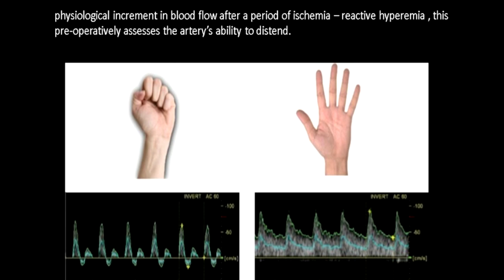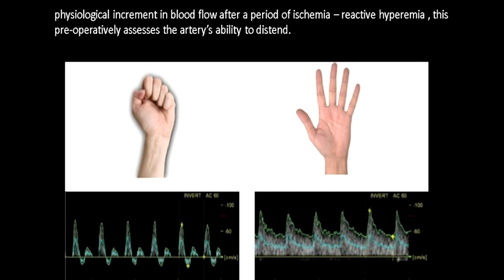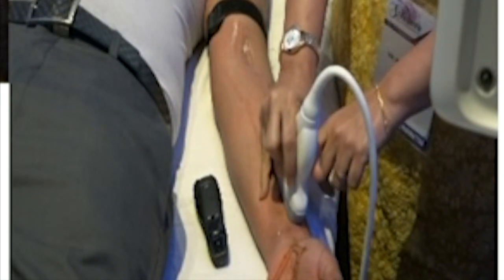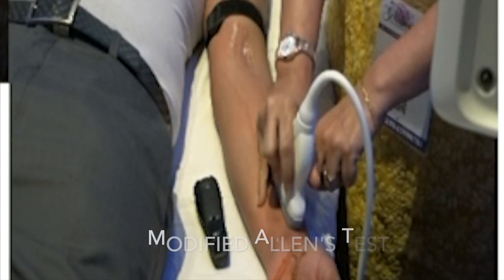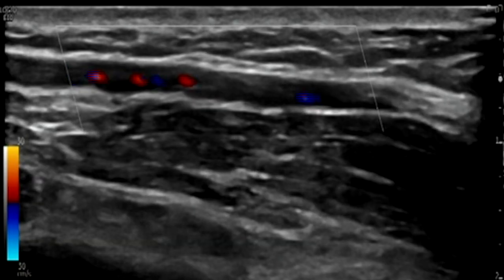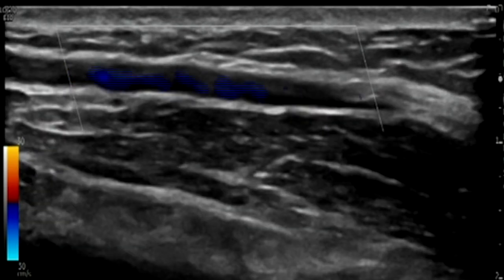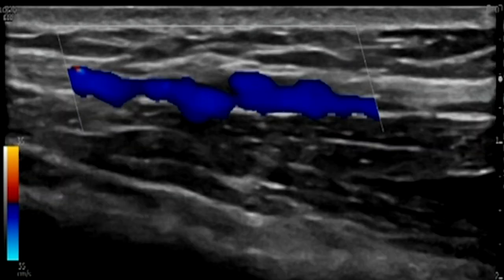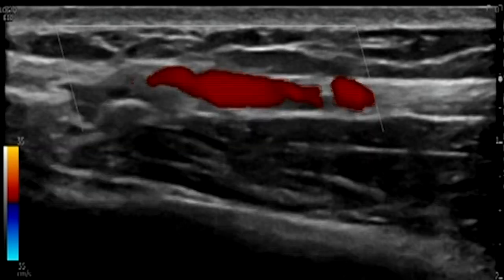Reactive hyperemia pre-operatively assesses the artery's ability to distend — its elasticity property. This is important because when constructing a fistula, you're diverting blood from high-resistance circulation directly to a very low-pressure circulation, bypassing the capillaries. This hemodynamic change must be acceptable to both the artery and vein. Reactive hyperemia should always appear in the report. One more good test is the modified Allen's test, in which you compress the vessel cranially to the transducer and see a reversal of flow — blue flow — confirming that the palmar arch is patent.